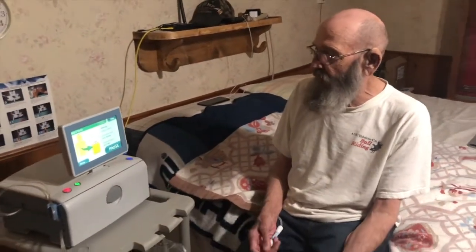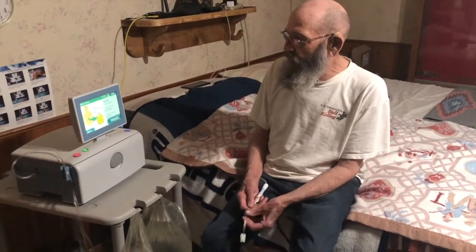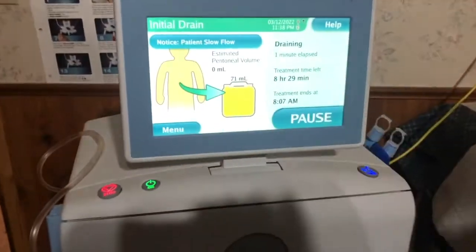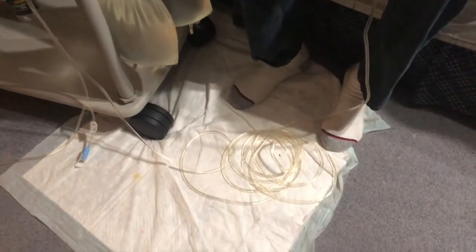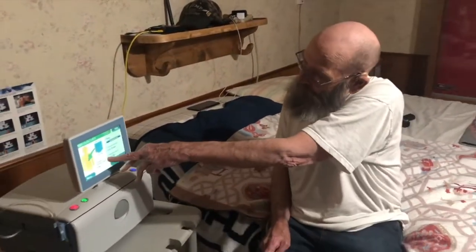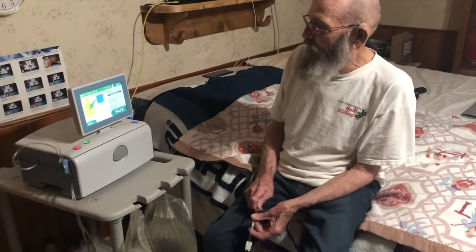67. That cycles all night. Well, it cycles 4 different times tonight. This first cycle will work for up to 10 minutes trying to get stuff out of me, and when it finally gets this notice here, patient slow flow, that means we're just about at the end of our rope, and we got 71 now, and that thing is going to turn and start pushing the fluid back into me. You can see it going back. So we got 71 out of there. That's our initial drain for tonight. And then it'll fill me up with 2,777 milliliters of fluid for this first cycle.